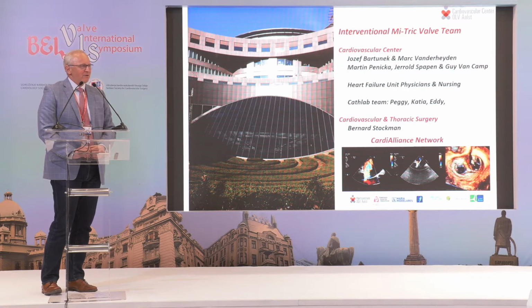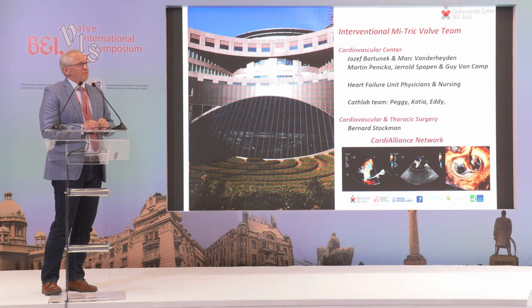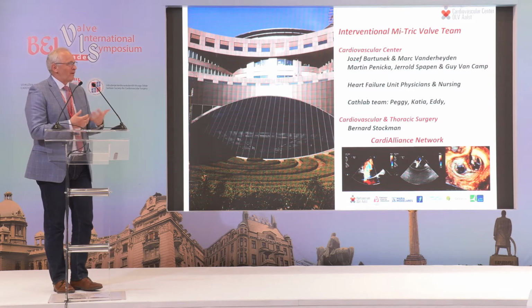We have done the analysis of our series, again a propensity match scoring, with the heart surgery done by Hugo Vanermen and Frank van Praet. When taking our first experience with the MitraClip, I think 30 versus 60 patients, something like that, we have seen that indeed functional MR at follow-up was always better with the surgery as compared to MitraClip. The mortality curves and admissions were sort of going parallel. That's maybe, but it's again retrospective, small data sets.